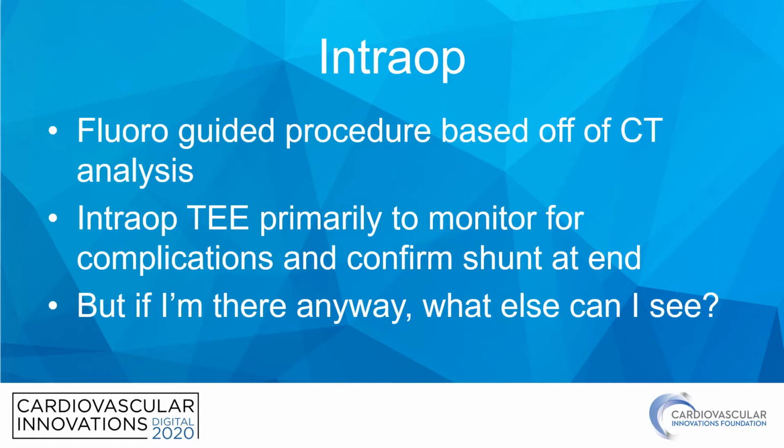This is described as a fluoro-guided procedure based off of CT analysis. Intraoperative TEE is described as being there to monitor for complications and confirm the shunt at the end of the procedure. No formal echo protocol is otherwise described, but since I'm standing there anyway, I thought it'd be good to see what imaging can be obtained by TEE during the procedure.